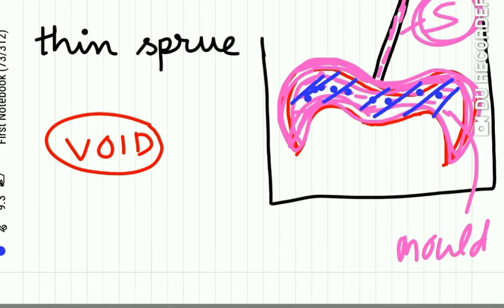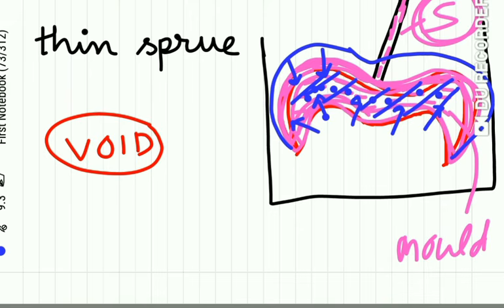And because of the solidification, we have seen there is always some amount of shrinkage which occurs. Now, this shrinkage causes more space for the molten metal to occupy. There is shrinkage of this casting and more metal is required to fill this space which is caused due to shrinkage. You can see here the white, this is the space which is formed due to this casting shrinkage.